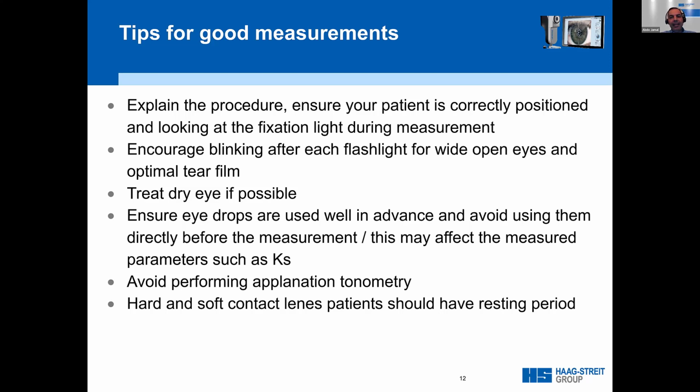So explaining the test will be a relief for them. Ensure the patient is in a comfortable posture in front of the device, correctly positioned and looking at the fixation. Encourage blinking after each flashlight for a wide open eye and optimum tear film.